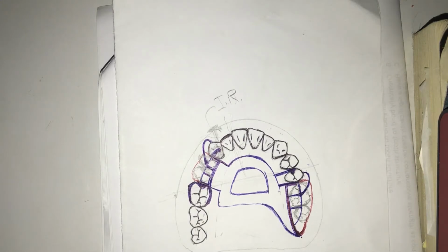And of course, as promised, this will be your guide or a demo video for writing your work authorization or your prescription. So, your work authorization is actually a written direction to your laboratory technician for the exact procedures on how your technicians are going to fabricate your dental restorations.